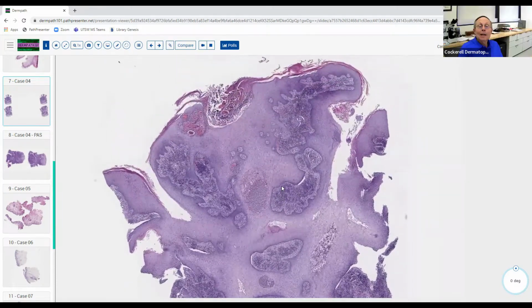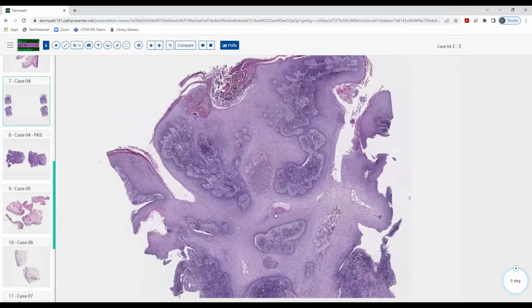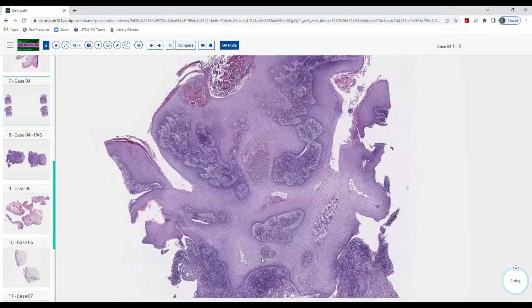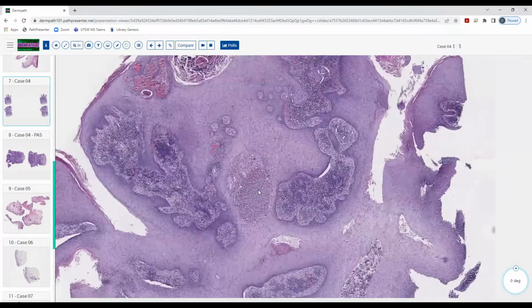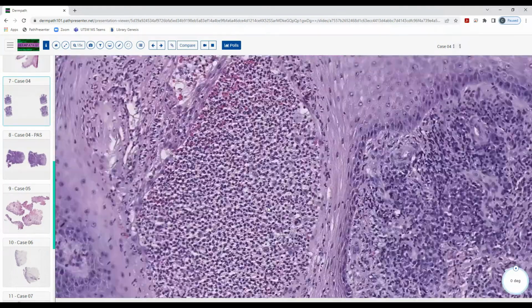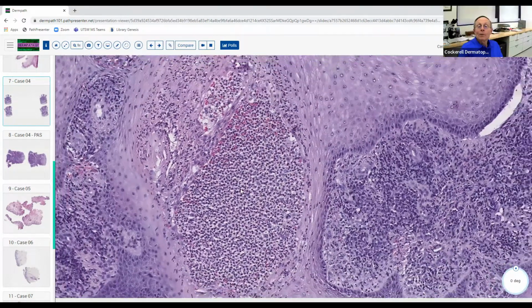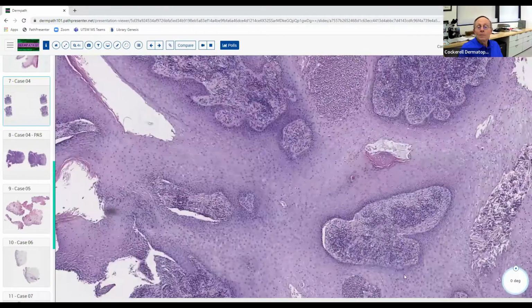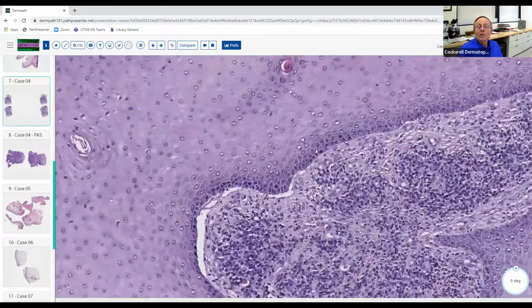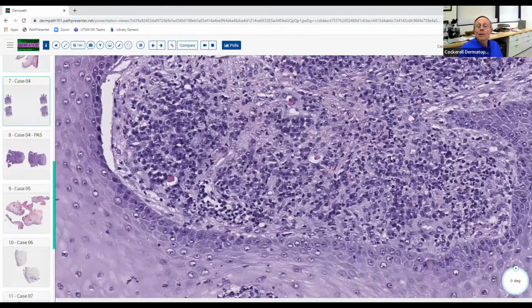And then let's see. You think it's an inflammatory process? It could be. I think I'm seeing some islands of potentially neutrophils and lymphocytes. Right. Neutrophils, lymphocytes, and if we look around, I'm sure we'll find some histiocytes in here also. Like over here, there's some granulomatous inflammation.